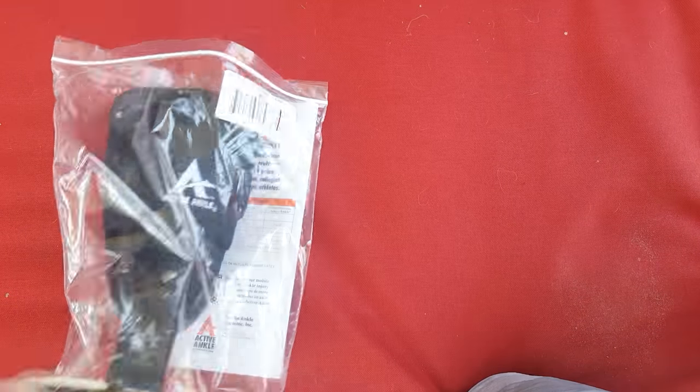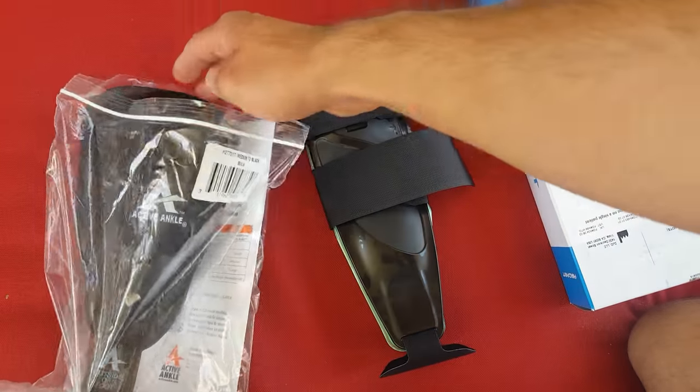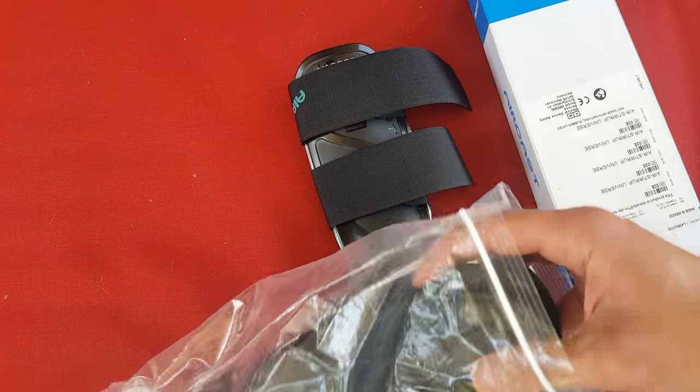Hi, this is Dr. Kolodanker and we're going to go over how to pick a correct ankle brace. The choice really depends on the severity of the injury and the timeline you're looking to wear a brace.